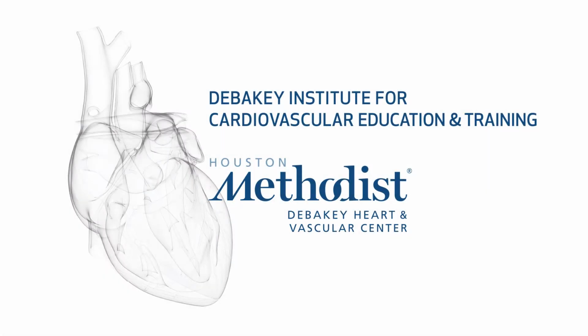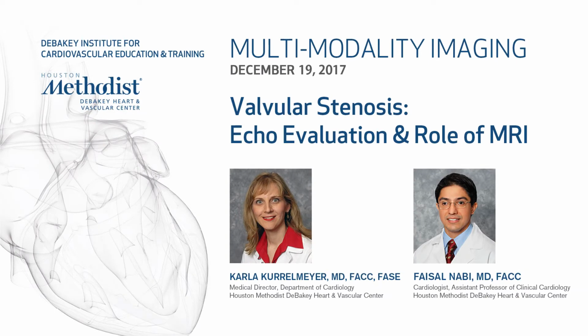We're talking about valvular stenosis. I'll do the first 30 minutes, and Dr. Nabi is going to do the last 30 minutes talking about the role of MRI in valvular stenosis.